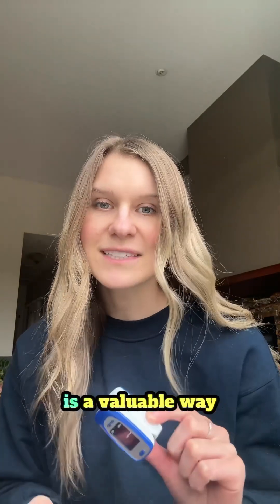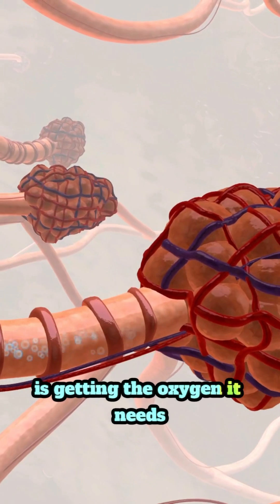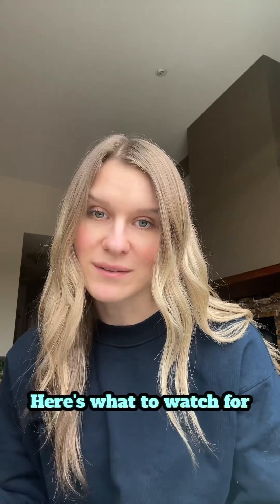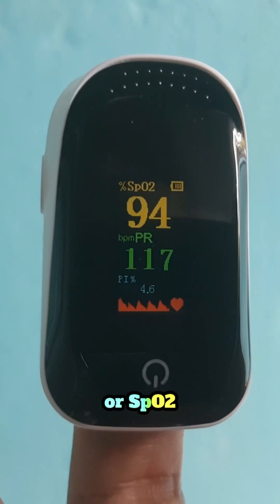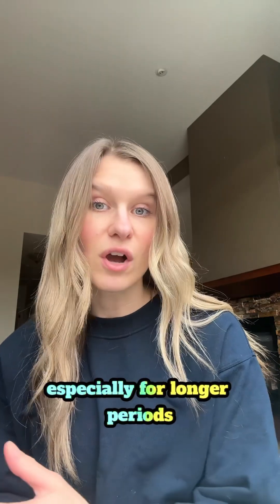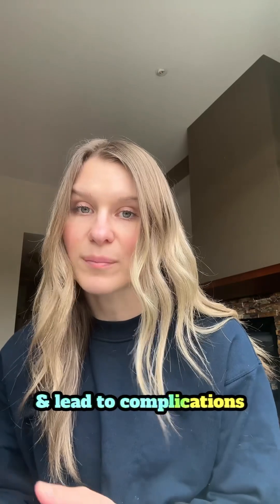Using a pulse oximeter is a valuable way to make sure that your body is getting the oxygen it needs, especially when you're exercising. Here's what to watch for. Your oxygen saturation, or SpO2, should ideally stay above 92%. If it drops below 88%, especially for longer periods, it can put added stress on your body and lead to complications.